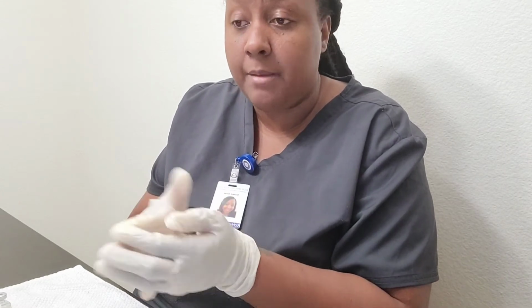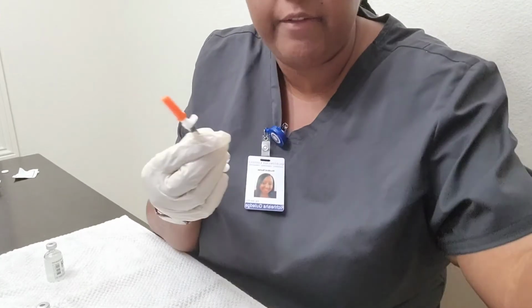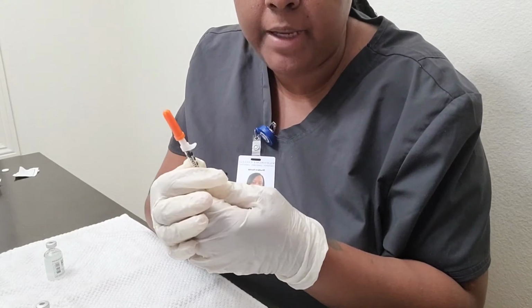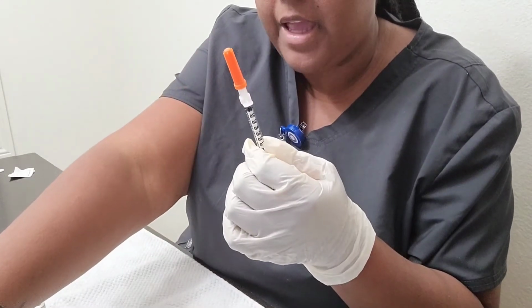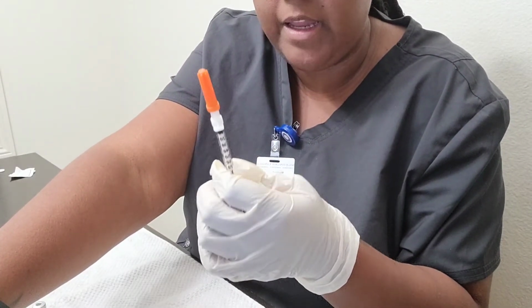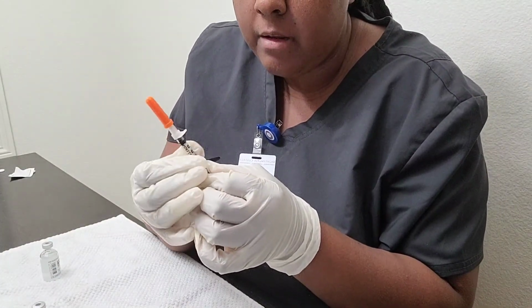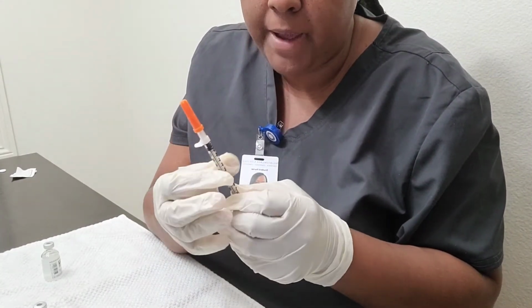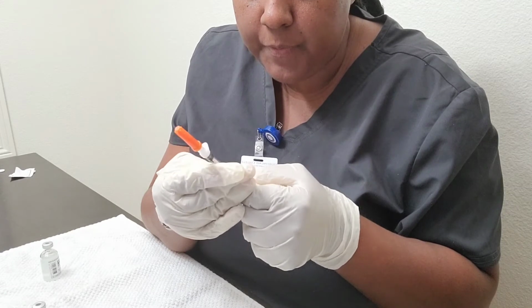So then, preparing the medication, I will calculate again the correct dose. Okay, so I now have my syringe. Leaving the top one, I need to go ahead and draw back the intermediate insulin, which is the NPH, needs to be 8 units. So we need 8 units of NPH, and that's the amount of air that I will draw back into the syringe, which is 8 units.